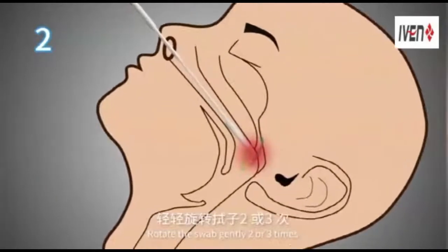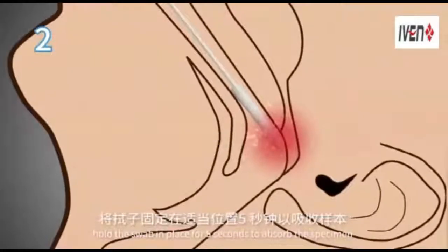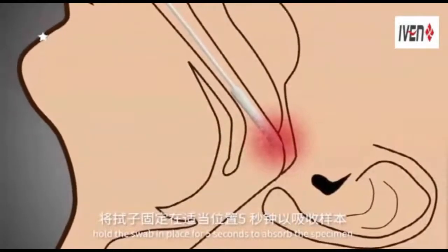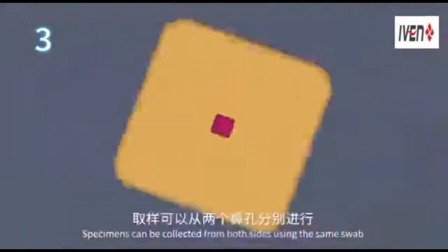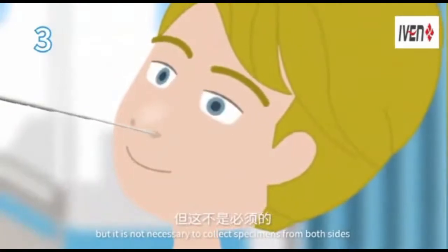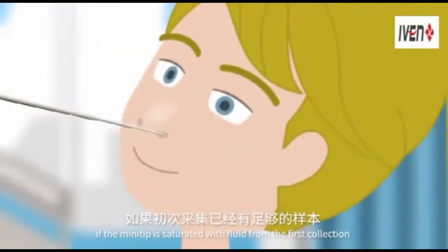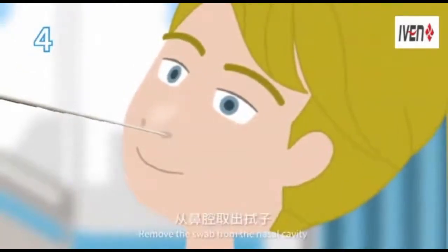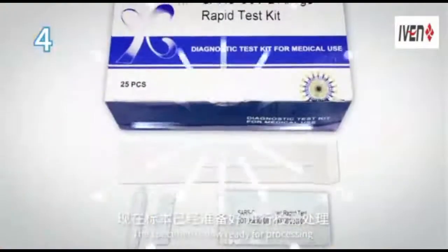Rotate the swab gently 2 or 3 times. Hold the swab in place for 5 seconds to absorb the specimen. Step 3. Specimens can be collected from both sides using the same swab, but it's not necessary to collect specimens from both sides if the mini tip is saturated with fluid from the first collection. Step 4. Remove the swab from the nasal cavity. The specimen is now ready for processing.